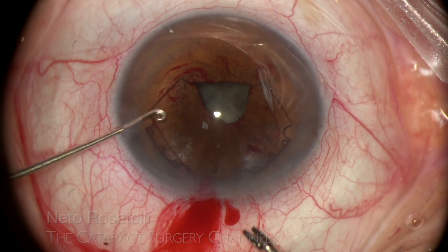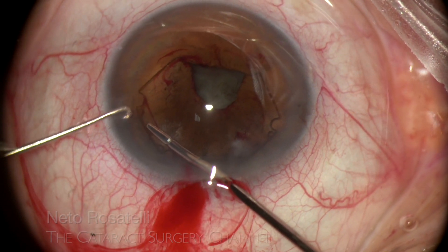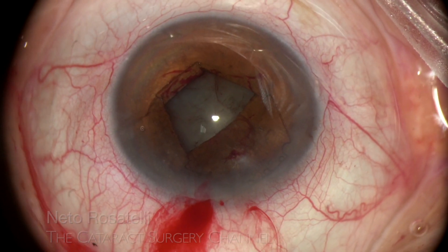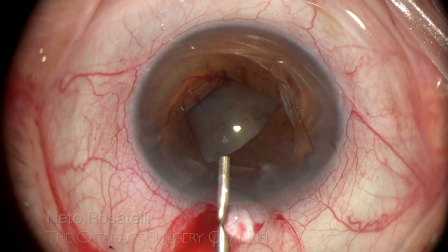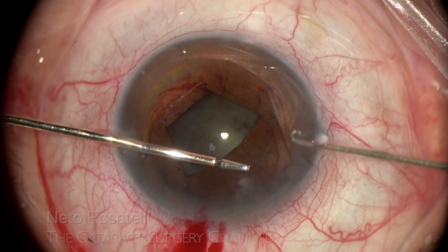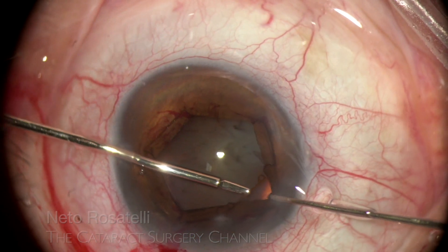Under 4.5 mm pupils are usually stretched to allow for easier insertion of the B-hex, but here I decide to use a second instrument to help — an iris hook. The micro forceps goes from the main incision to grab the 2 o'clock flange, and the iris hook delicately pulls the iris for an easy engagement. Now for the other flange at 10 o'clock: the forceps is switched to the left hand, going from the left side port, and the iris hook does its job from the right side, proving that nothing beats perfect teamwork.